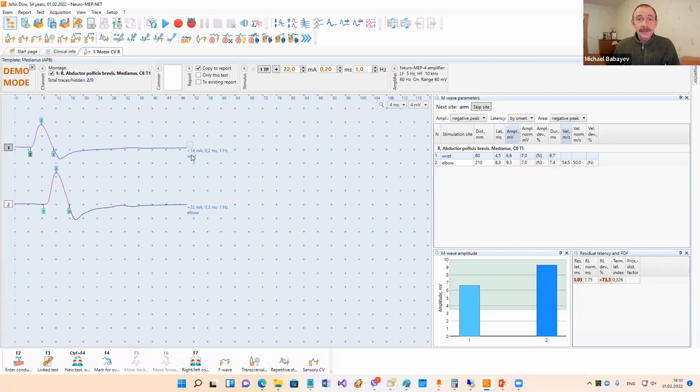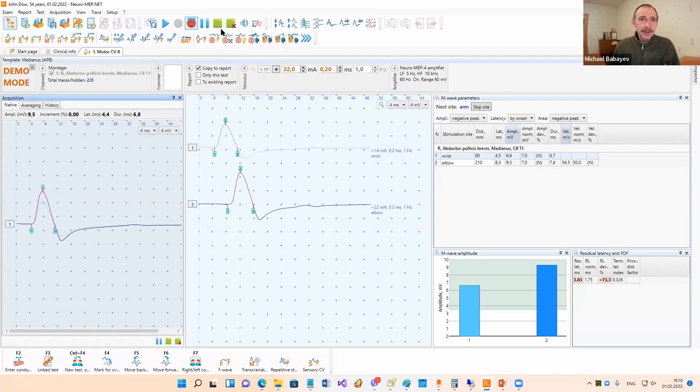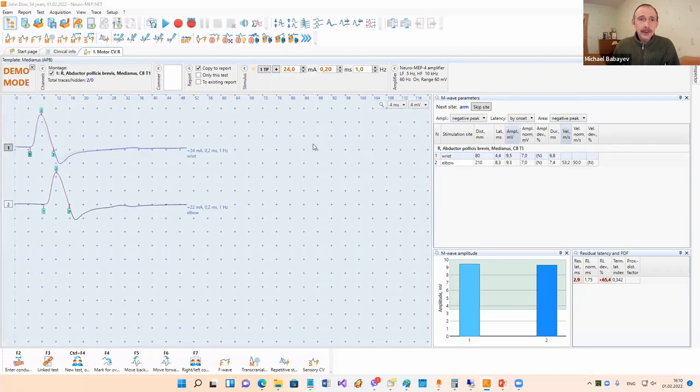I have to change this trace to another one. How to do it in our system? Very easy. You can press F4 or click this button, and we overwrite this trace, then start stimulation again. Increase stimulus intensity and put it into analysis. Now you can see we changed the trace. Moreover, you can overwrite as many traces as you like, and later select which trace to put into analysis using the F5 and F6 buttons.